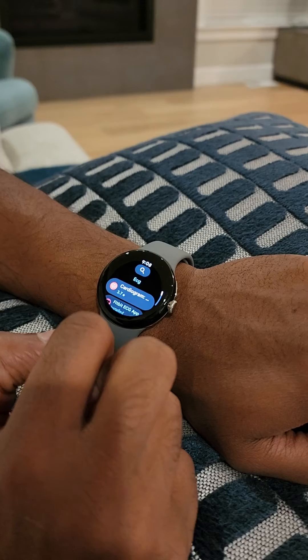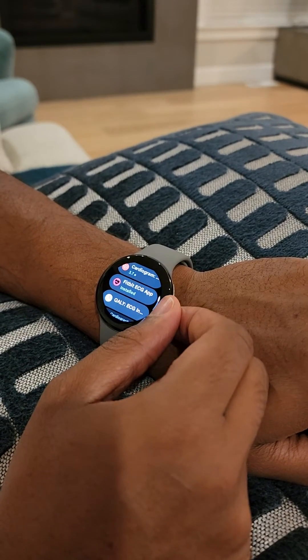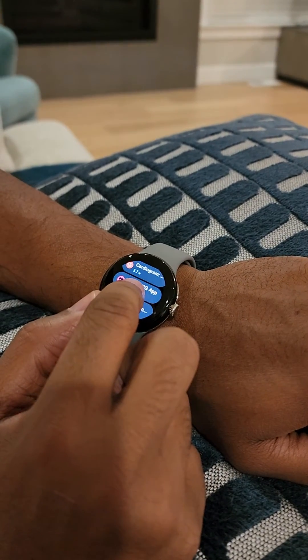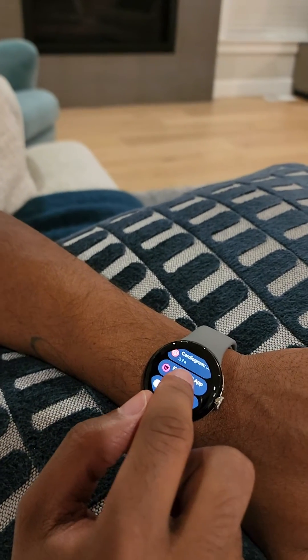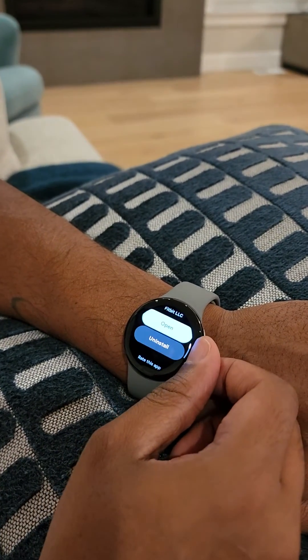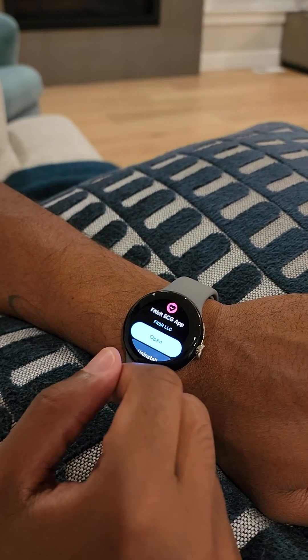So you search, and it actually brought up the Fitbit ECG app. At the time, it showed that it was installed but not updated. So I clicked on it, and it gave me an option to update from here. And as you can see, I've already updated it.